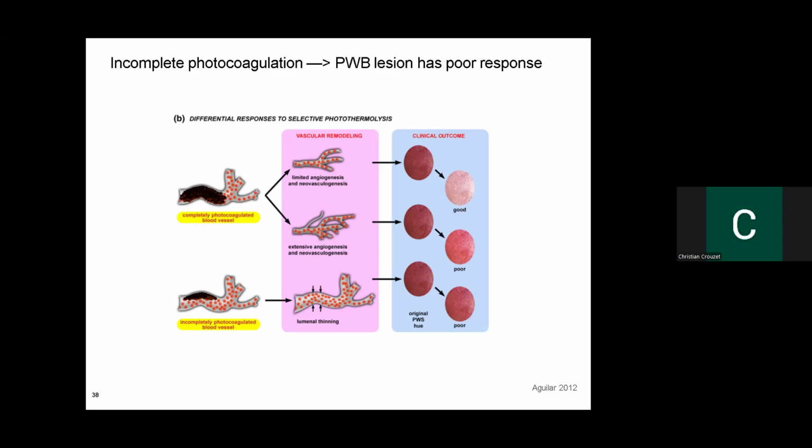It's a good question. Usually it may offer some benefit, but due to the scattering of tissue, it's going to be really challenging to do that, at least with the imaging-based method. There are point source techniques, diffuse correlation spectroscopy, if anyone knows about them, that are able to resolve flow much deeper than laser speckle imaging, which is a much more superficial technique than those point source measurements. But here you have an image that you can deal with versus a single point source measurement.